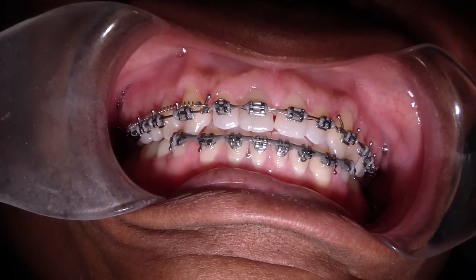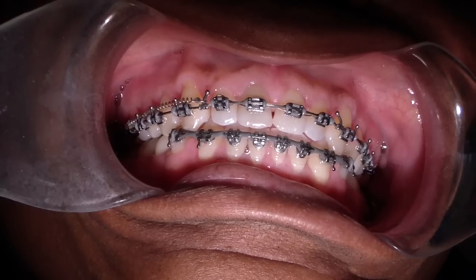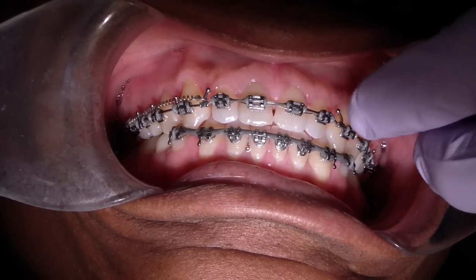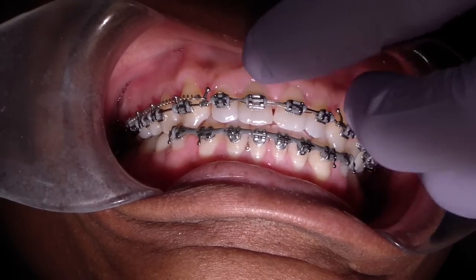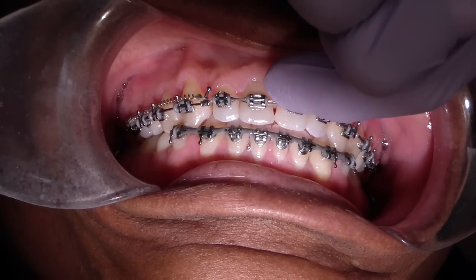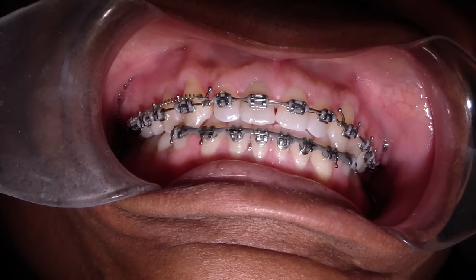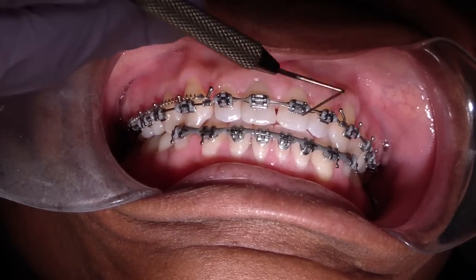Hey Ashley, allthingsentry.com. We've got patient CC in the chair, just doing a continuation of his ortho treatment. We're almost completed. What we're doing right now is retracting the anterior segment with these nitide coils, and you can see that what we've been mainly looking at comparing from appointment to appointment is the amount of wire that comes out the distal tubes.